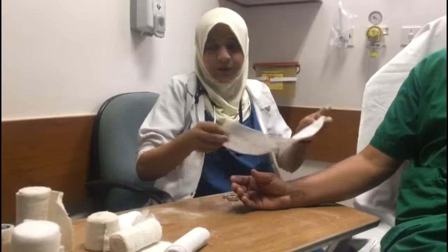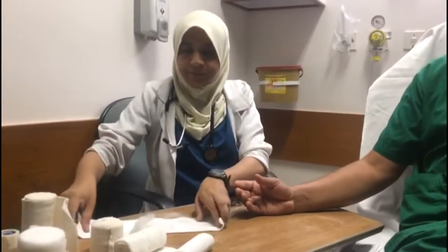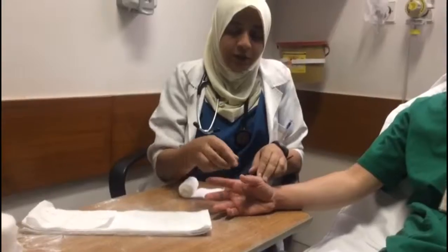The thumb spica may be made from one splint along the thumb and the radial aspect of the wrist, or two separate non-pre-padded plaster splints, keeping the hand in neutral position.